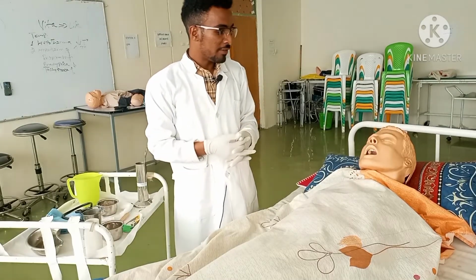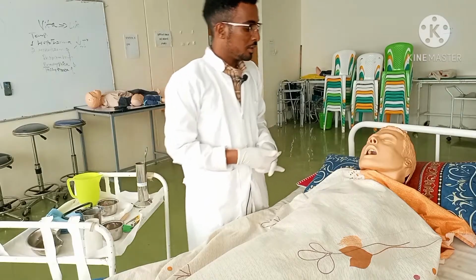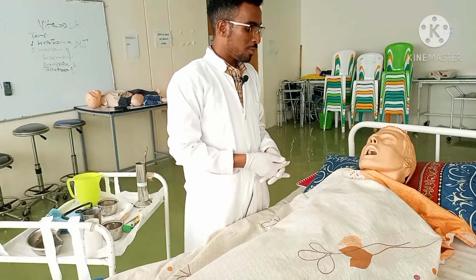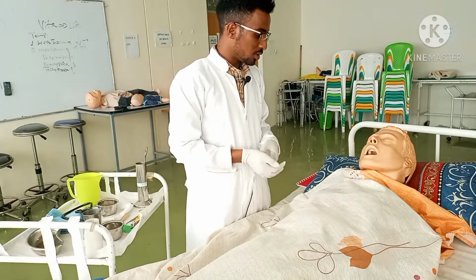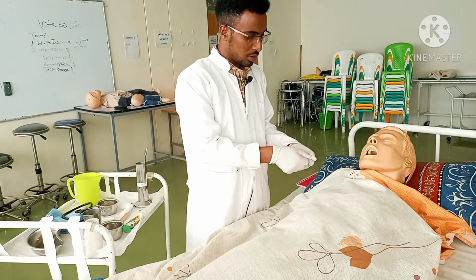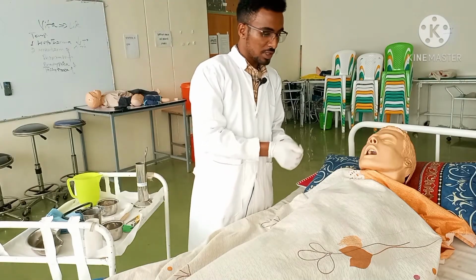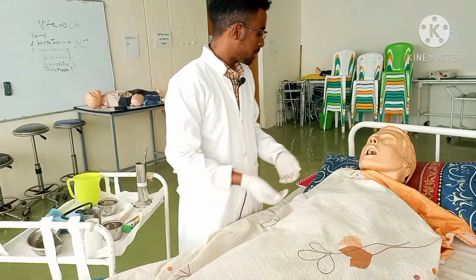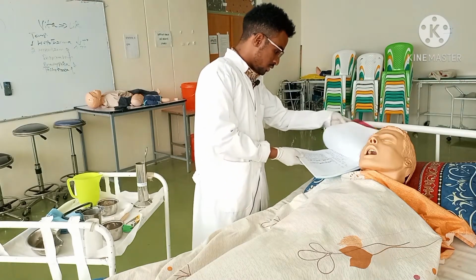After wearing a clean glove, you have to explain the procedure to the patient and greet the patient well. Mr. John, I am Yoni, working in this hospital. I am going to help you. You have an abdominal distension that is due to accumulation of gas in your stomach. Here we need to insert a tube into a nostril, down the esophagus into the stomach, to decompress and relieve your abdominal distension. It may have some discomfort during insertion. Do you agree with this? Okay, the patient has agreed. And make sure your patient is really John.